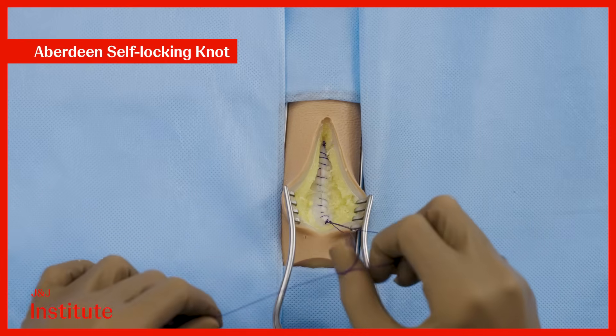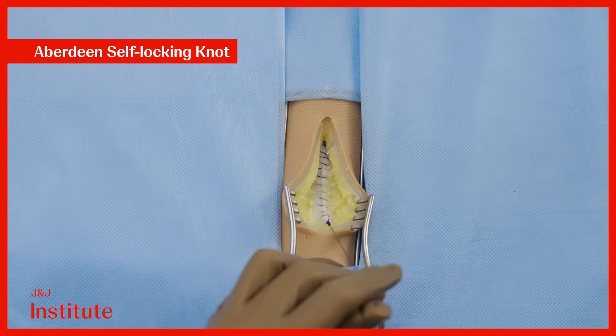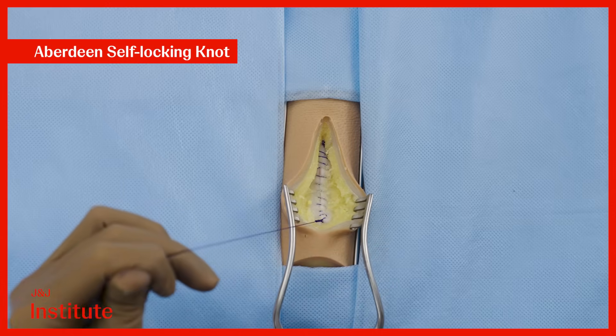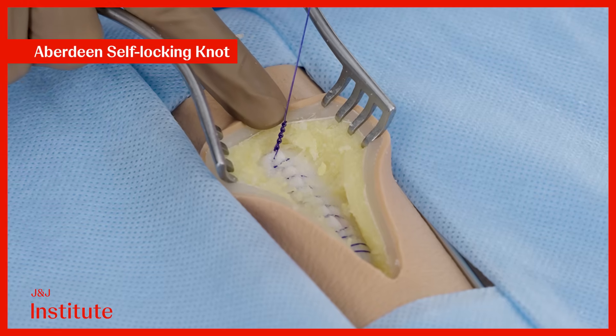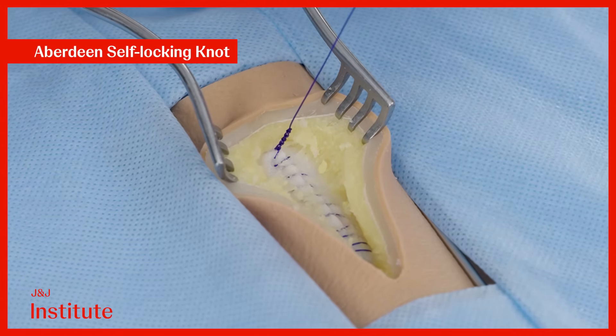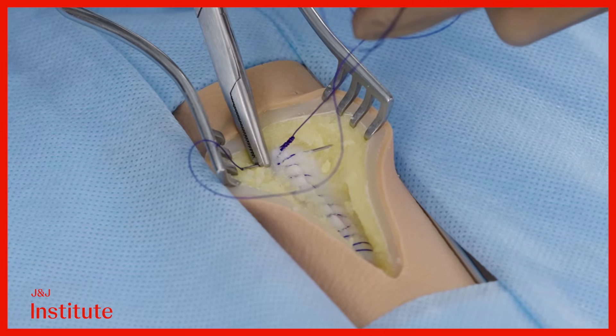Conclude the Aberdeen knot after 4 to 5 passes by passing the entire thread, including the needle, through the loop to lock it. As the Aberdeen knot is bulky, it's preferable to bury it. Pull up on the suture and take a pass extremely close to the knot.